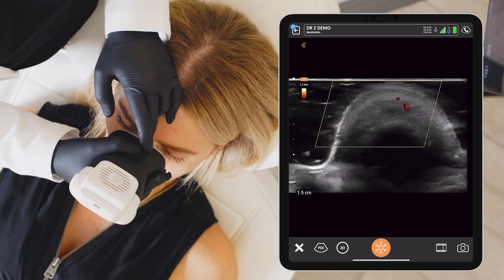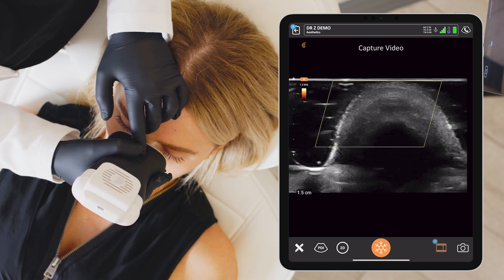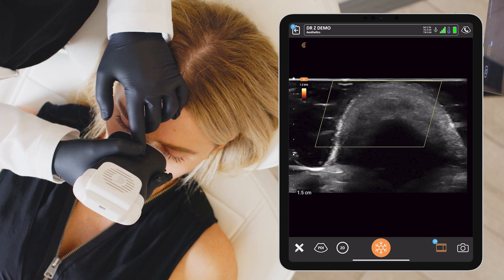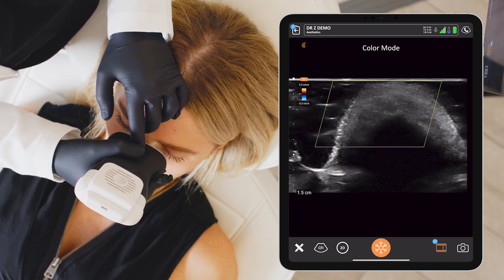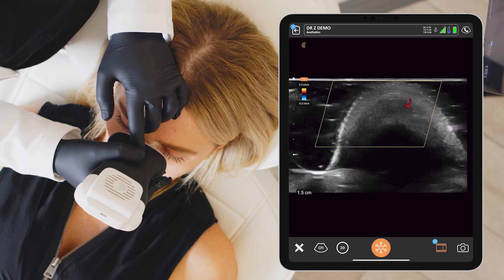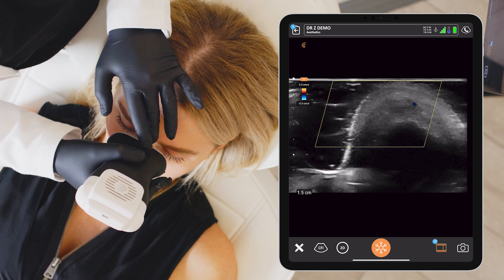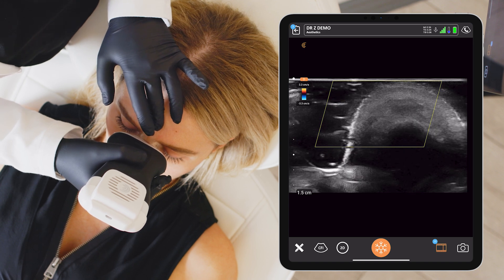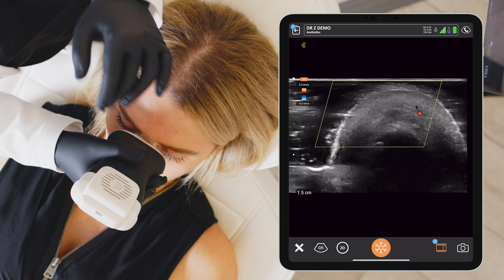I'll move to the transverse view to confirm — colour mode. We can see a vessel there, just lateral to the midline; however, it is not on the periosteum, which is the important thing here.